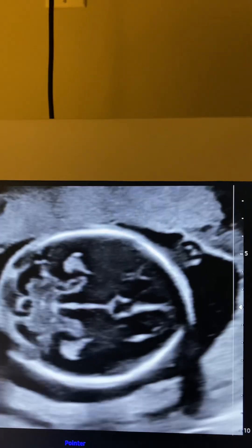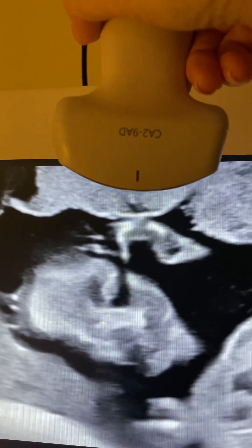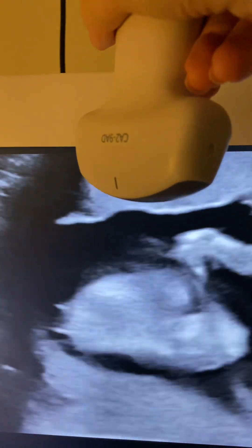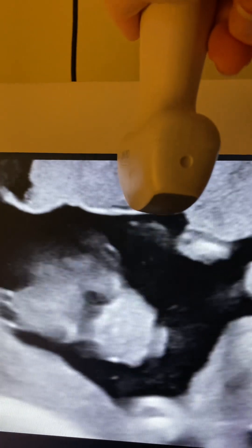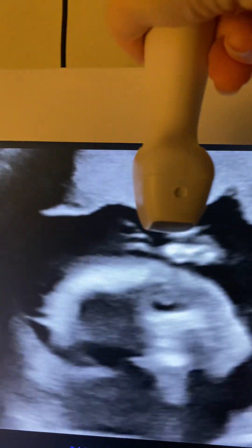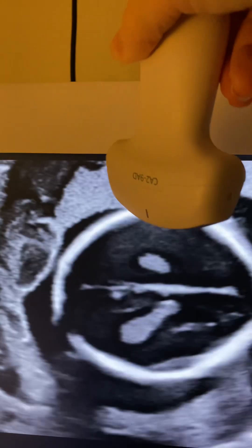So the other thing I'm going to show you is the nose lips shot. So once this rewinds, we are going to show that to you. So we're here at your head circumference — you're going to twist about 90 degrees for that one and then wiggle. Wiggling will get your nose to come in, so twisting and just kind of wiggling and that nose lips will come right in.